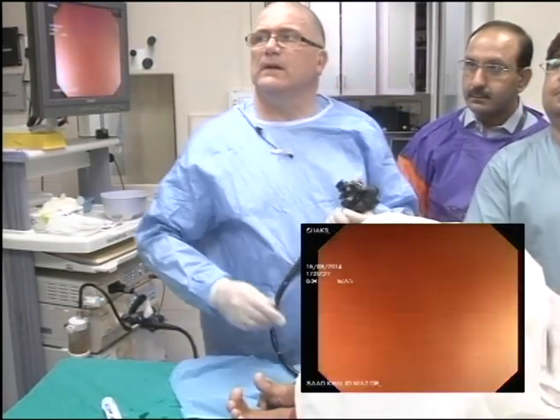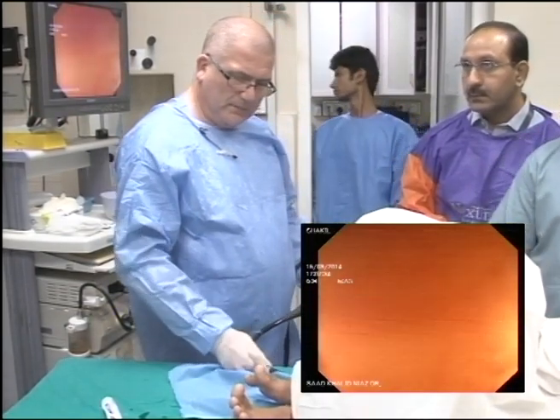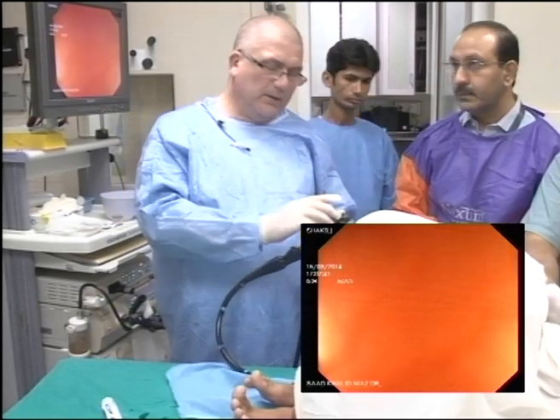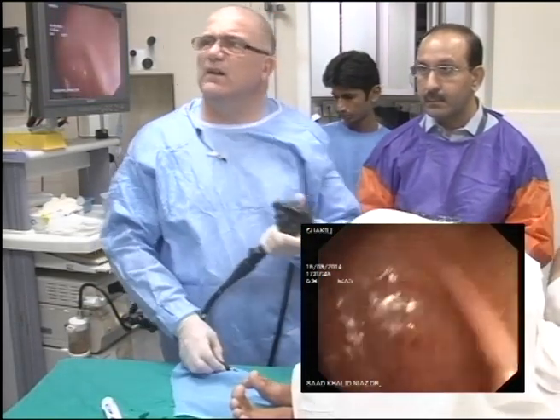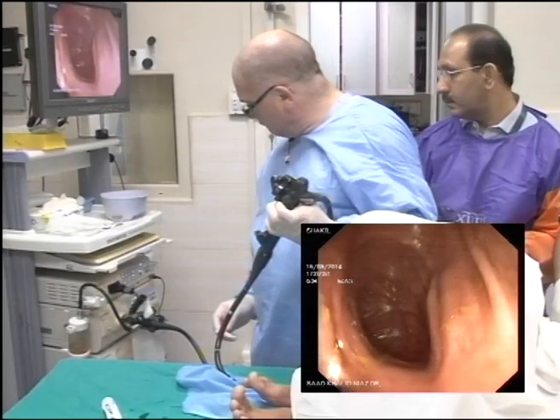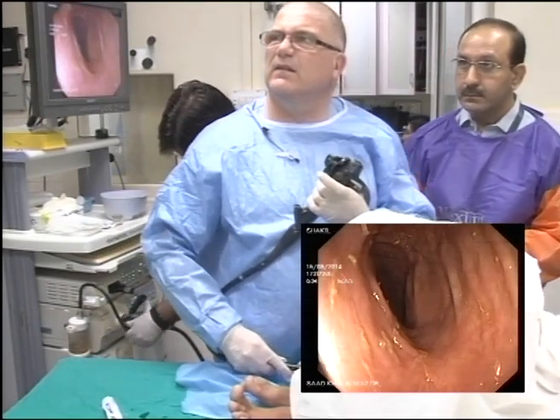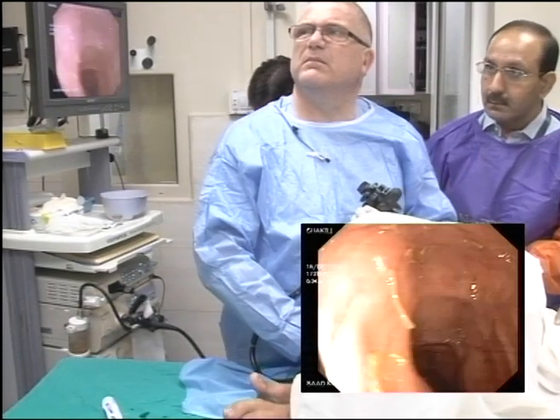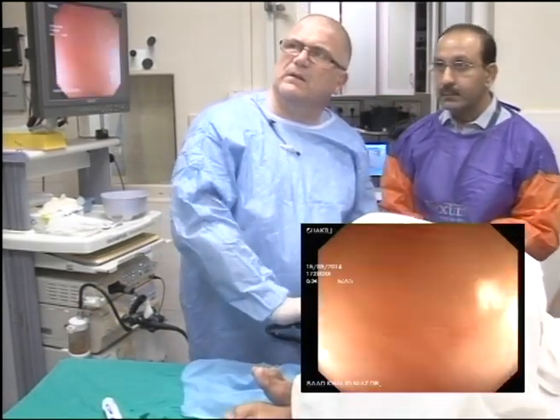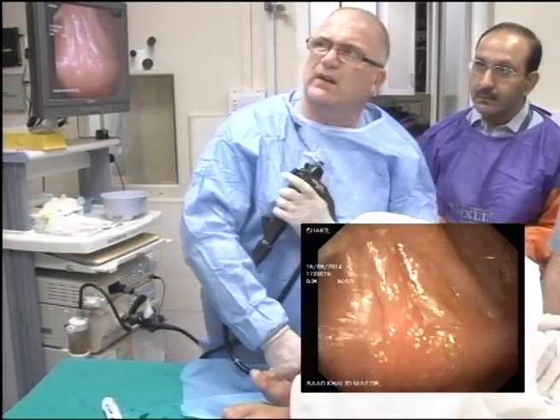Patient is complaining of pain. Look at his toes. So the little wheel neutral. Always make sure it's neutral. Just checking we have water. Now what's causing this patient pain is too much air early on. Too much air, yeah.